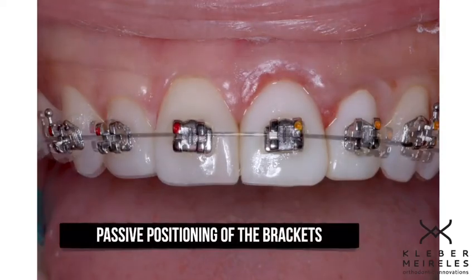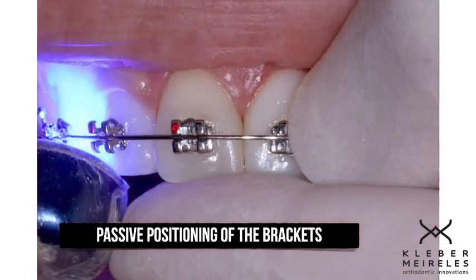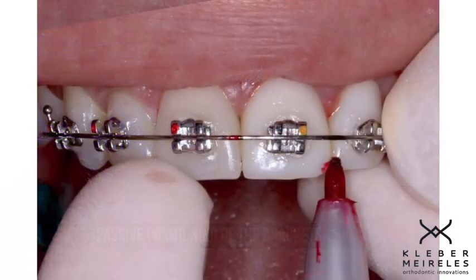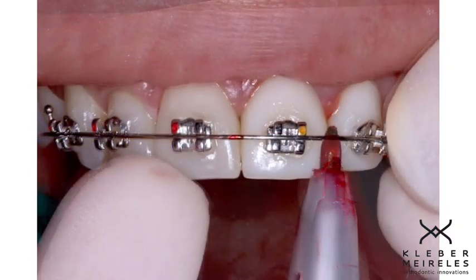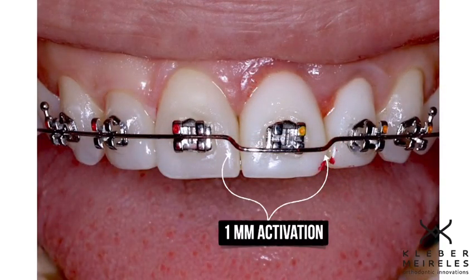This is the fast extrusion protocol. First of all, I'll do the passive positioning of the brackets and I will do the bend after that. Why the passive positioning? Because I don't want to apply NiTi wires here, just stainless steel.